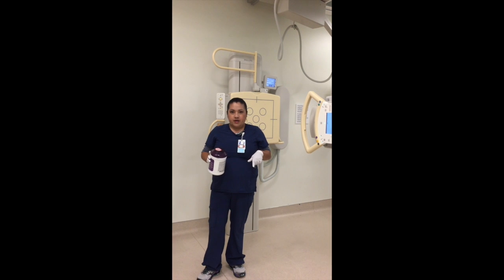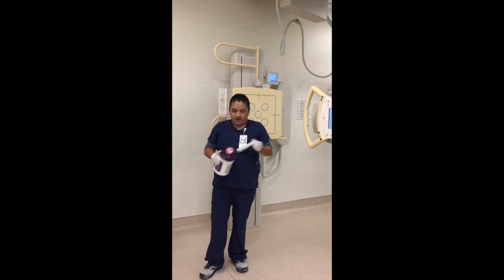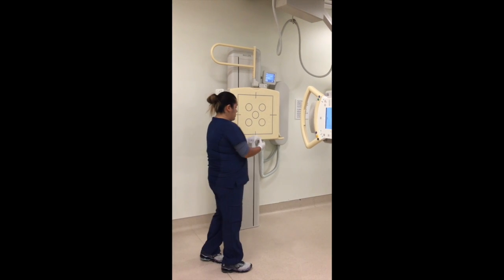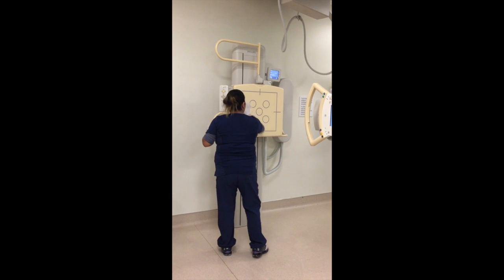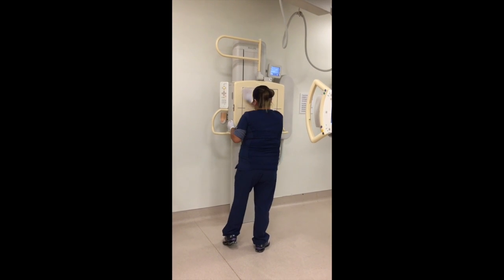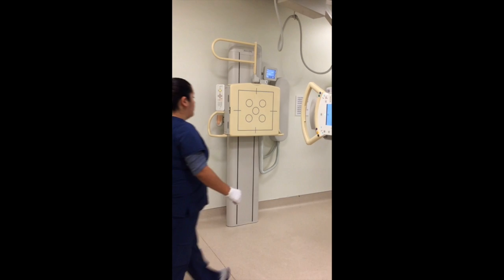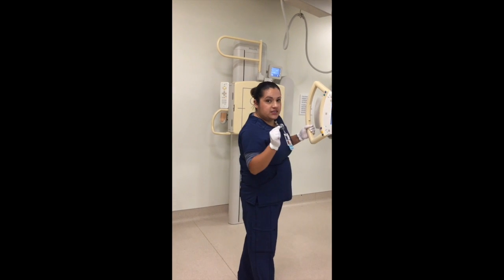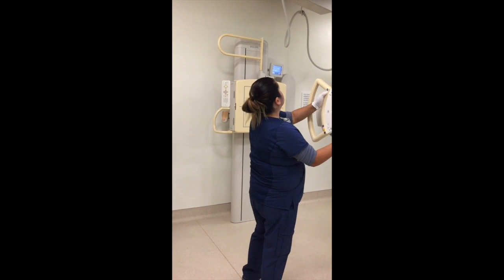Before I even get my patient, I'm going to set up the room, starting by cleaning the Bucky. And then I am going to detent my tube. So the SID for all these projections is 40 inches.